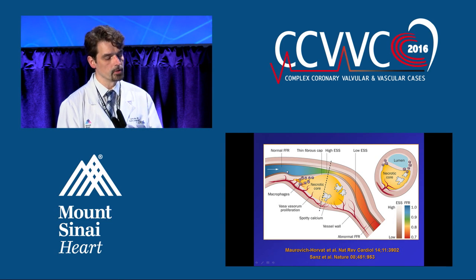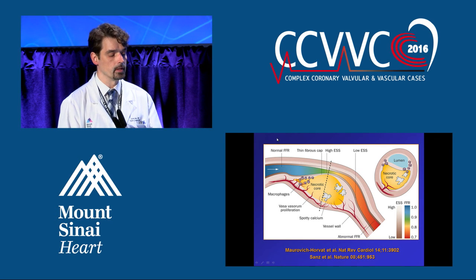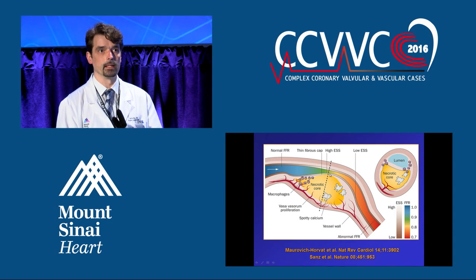This narrowing is going to create some alterations in the flow, which you can measure in the cath lab with the FFR, and also is going to create some changes in the plaque stress, in the shear stress. And that is going to also favor the rupture of the plaque when this stress increases in this area.